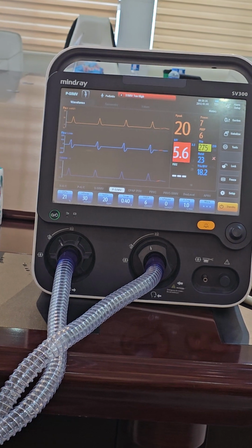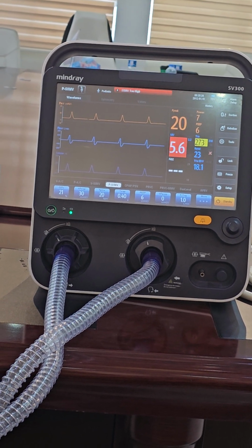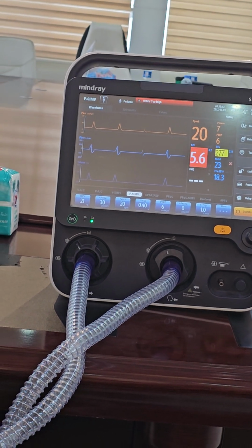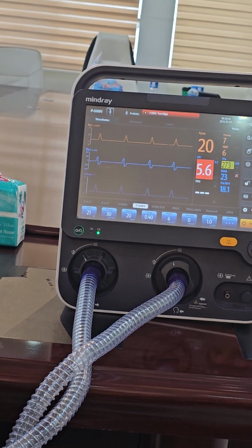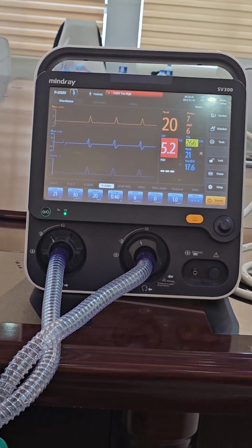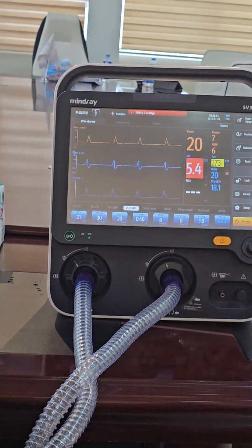The measured rate will be 60. Or if we are on SIMV mode, what will the rate be? 30. It only provides the mandatory, not the assisted.